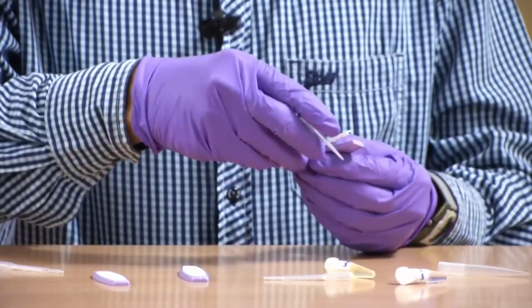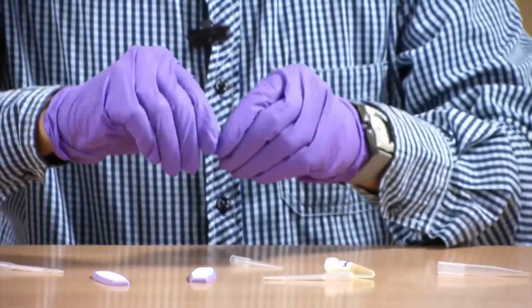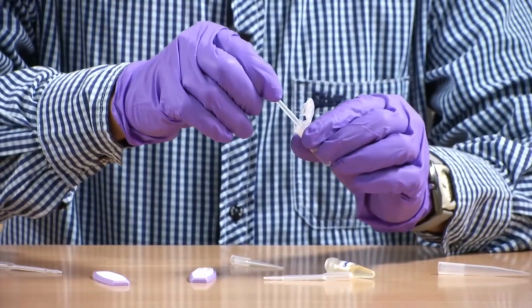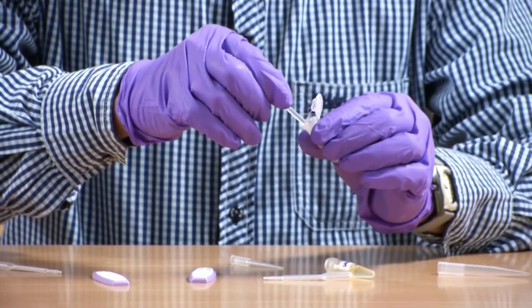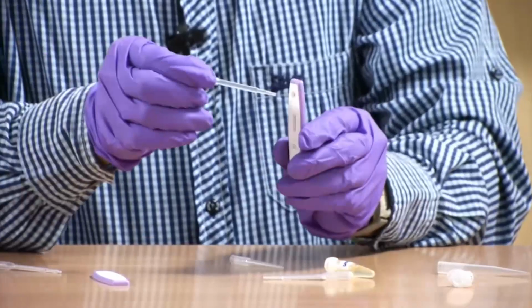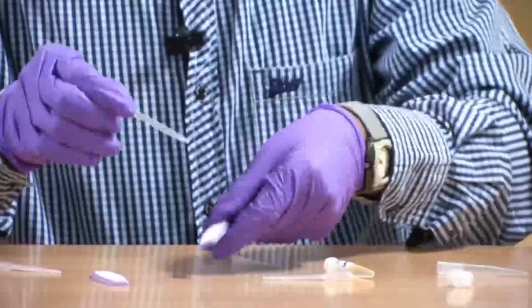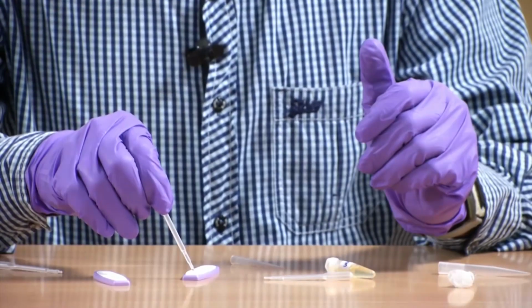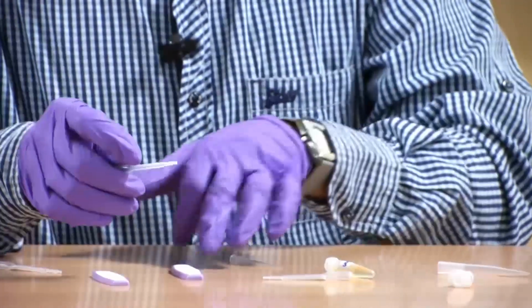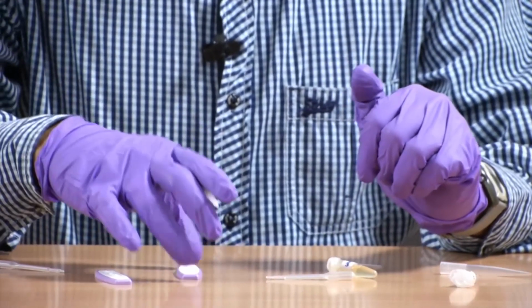So, in these 2 kits, in the first one I will add only the water. So, this is the sample port, where I will add the simple water. When I add the water, the sample will flow using capillary force, and in water there is no antigen.